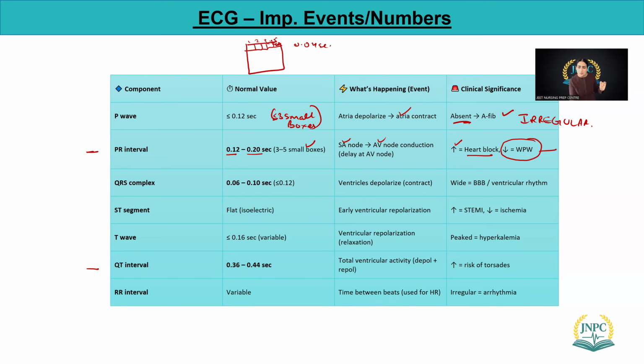Now, what is WPW? Anyone? That is called Wolff-Parkinson-White. Those were 3 people who first described this type of arrhythmia. We call it Wolff-Parkinson-White. It looks the same as SVT, an abnormally very high rate in the ventricles. It looks like SVT, but it's not. But it can cause SVT, a very high rate.